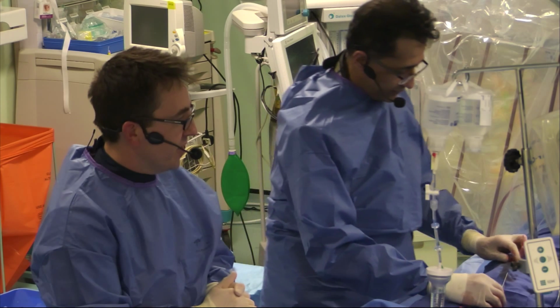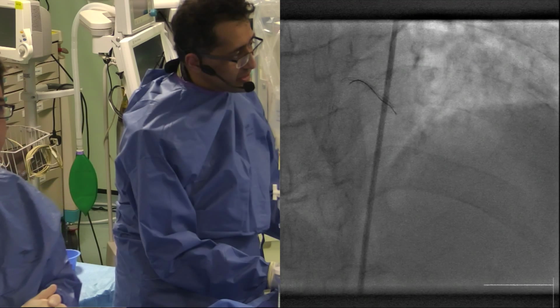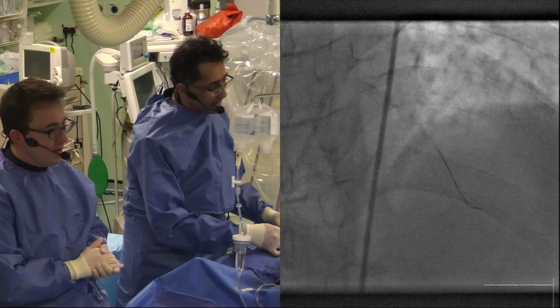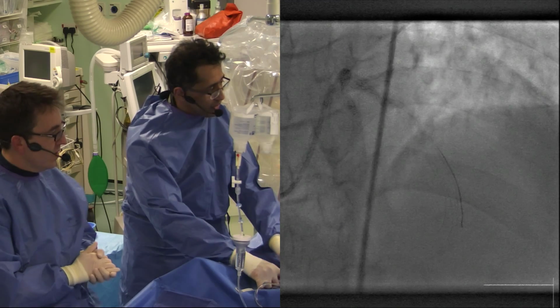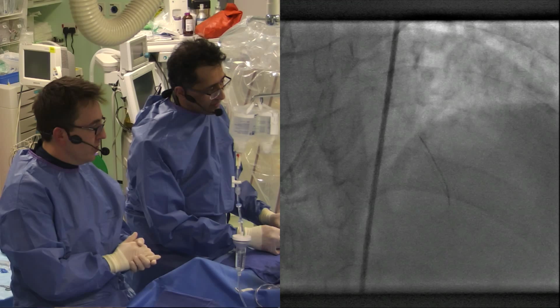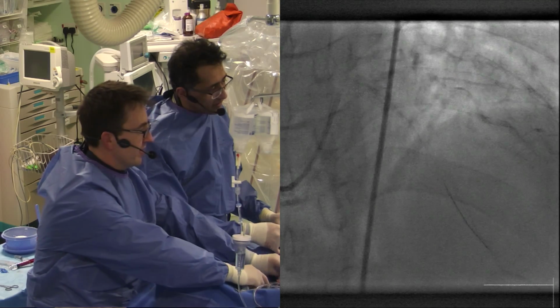So you're going to advance this wire down the vessel now, and perhaps we'll stay with you and see if this goes down nice and easily. Is there a stent in there already? Yeah, so the proximal vessel is stented, and the stent looks wide open. I've got a road map on my screen to avoid giving too much contrast, and I'm just wiggling the wire. And as I say, I really enjoy using these wires, and if we need to stent, I will just use this wire. I use this wire to do the whole procedure, and of course that allows us to use the physiology afterwards as well. So as you say, the wire is a very supple, steerable wire nowadays, and it's taking these little side branches as any good wire would do, and now you're making good progress down there.